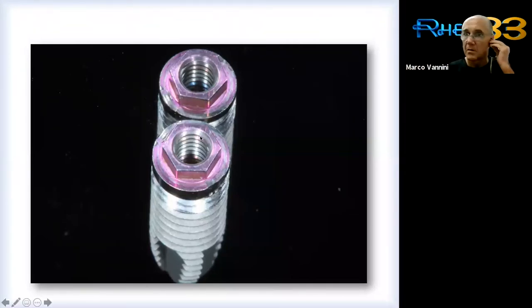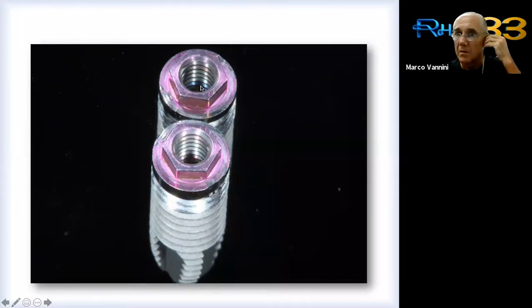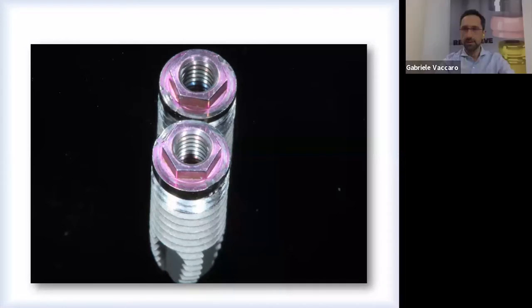The first implant that was put on the market was the external hexagon connection, and this was the Brånemark-like implant. Do you know what it was designed for? This external hexagon was designed not to fix teeth over the implant, but to fix the implant. It was just the connection with the mounter that locked the implant and allowed the dentist to screw the implant into the bone.